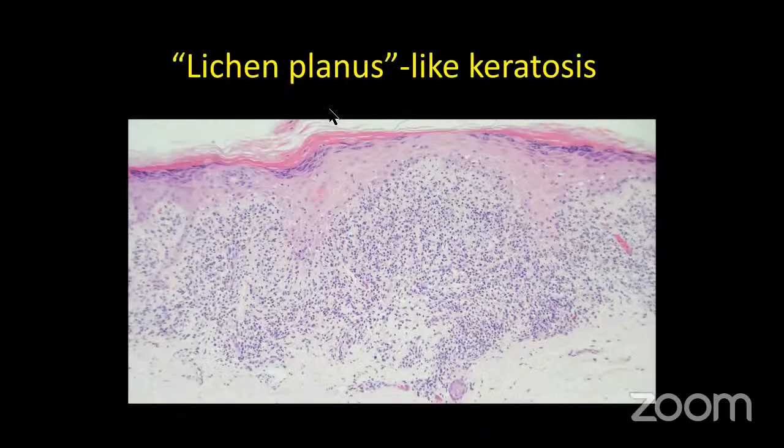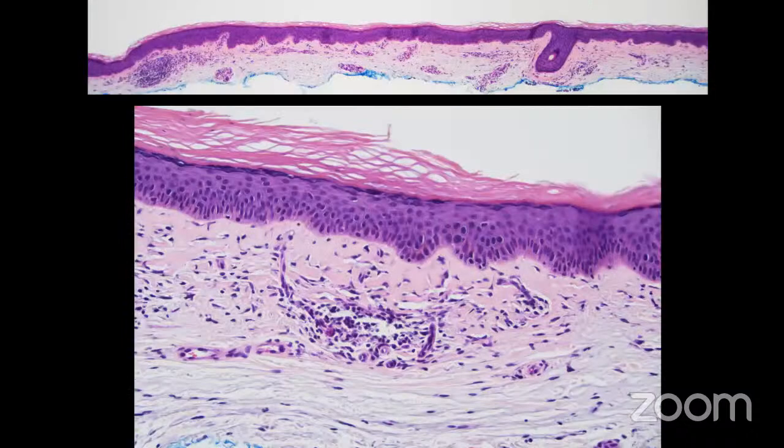It's referred to as lichen planus-like keratosis. So you can see here it's very lichen planus-like, but a lot of times it's not going to have the lichen planus features. It can just have a variety of different features that I showed you. This is just another one showing that the basal layer might have started to repair itself already. So that doesn't have too much.